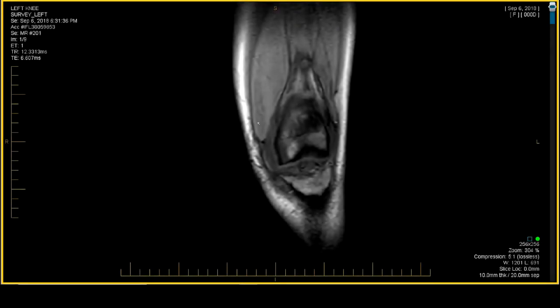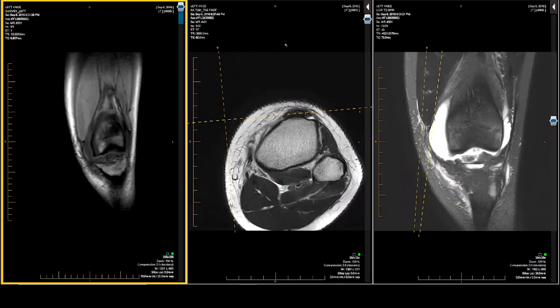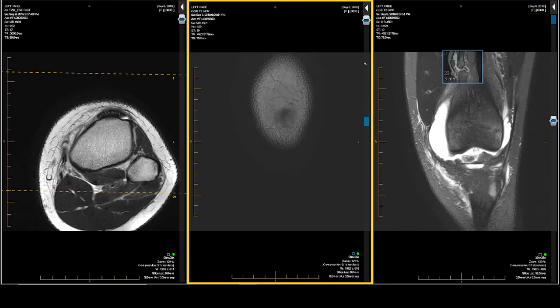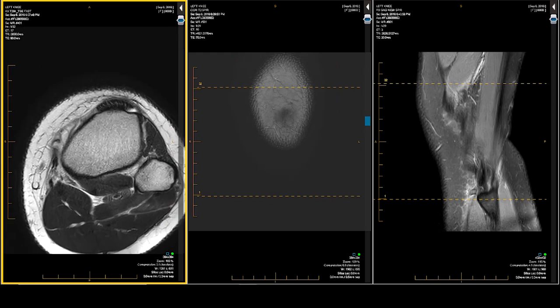This is a 15-year-old female. She had a volleyball injury. Evaluate for anterior cruciate ligament tear. I'm going to go three up — you can go two up if you wish. I'm going to pull down my axial, my coronal, and my sagittal water-weighted sequences.